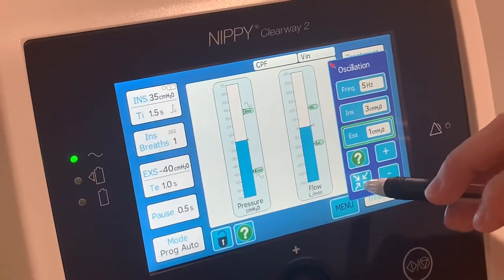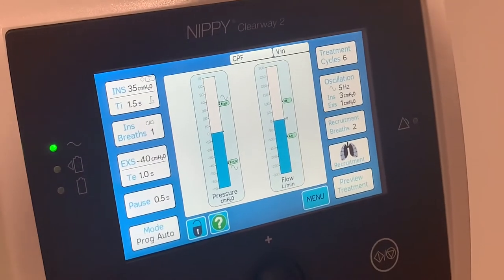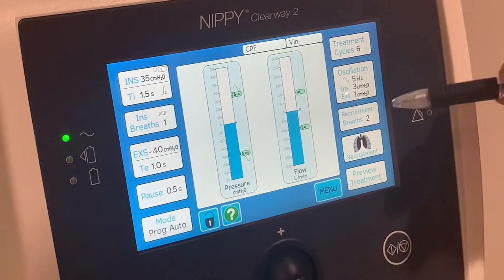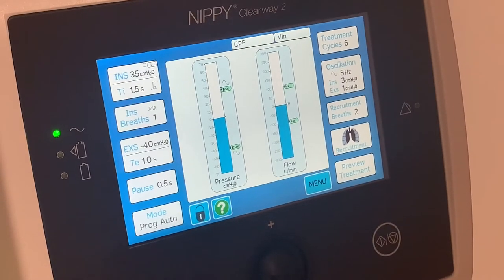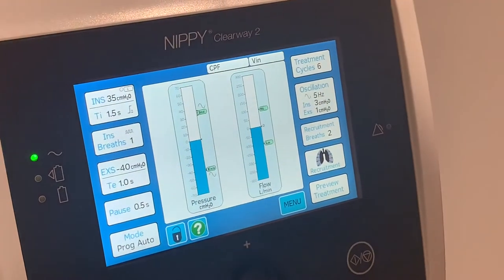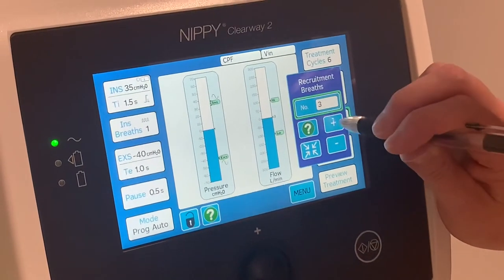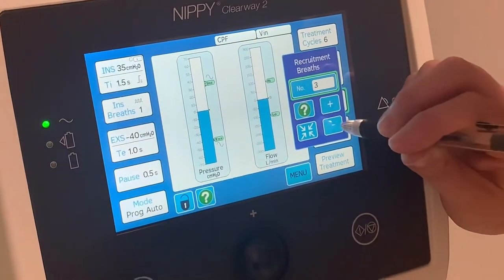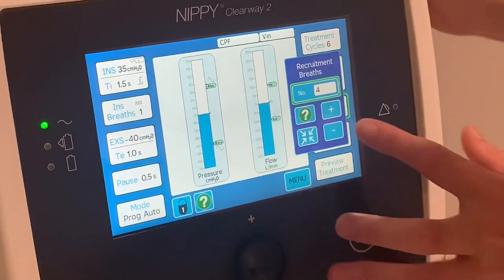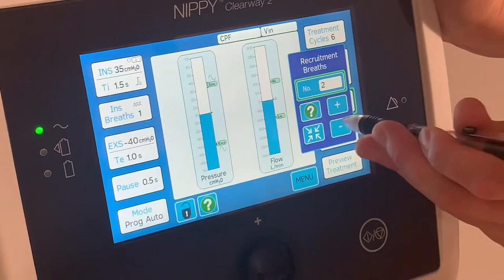Once your cycle is sorted and your circuit is connected, we have the recruitment breath option — that's your two breaths post cycle, the insufflation breaths we used on the previous Clearway. You can add up to 10 breaths if needed. The key thing to note is that the recruitment breaths do not automatically come on after your circuit finishes.